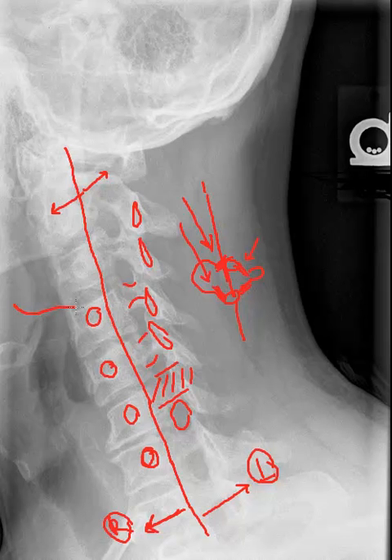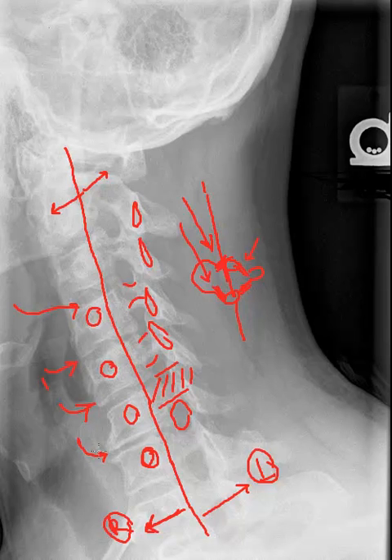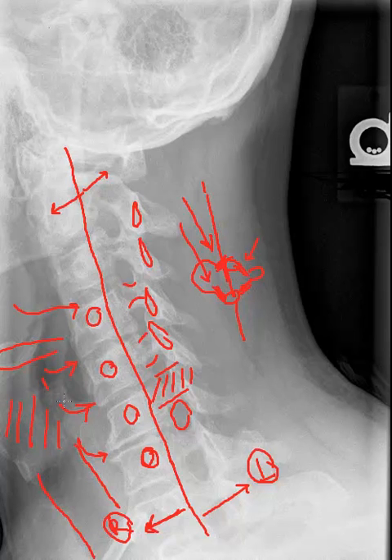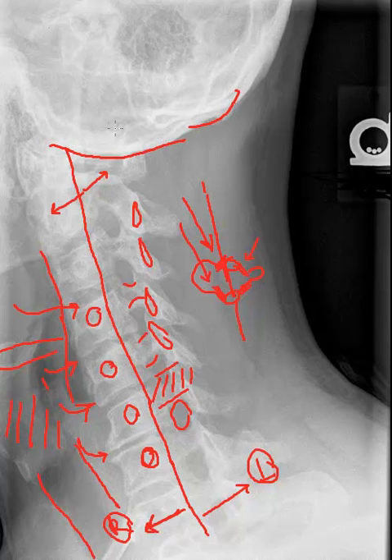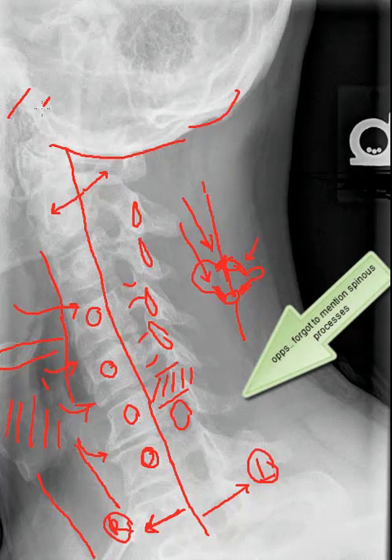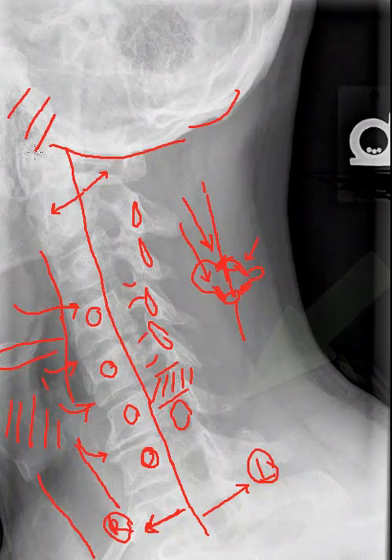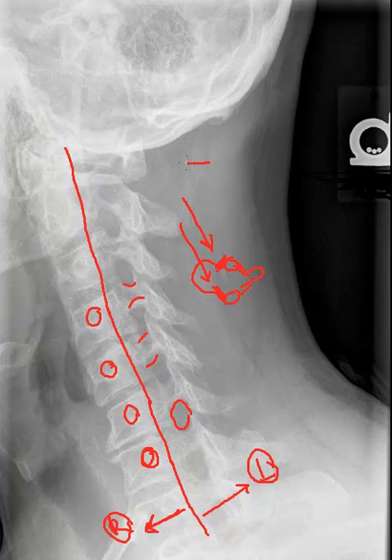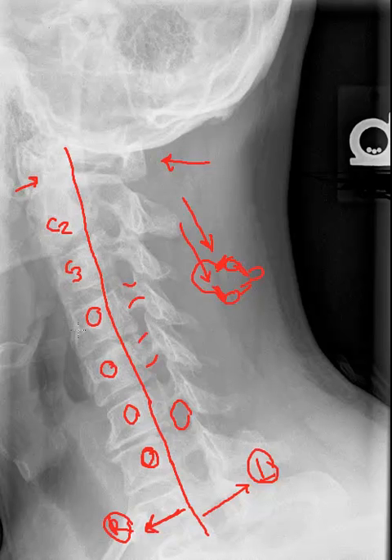To finish up with some anatomy: these are the intervertebral disc spaces. This patient demonstrates a little bit of narrowing at a particular level with some osteophyte formation, simply a sign of degeneration. Here we see the hyoid bone, some thyroid cartilage calcification, the air column in the trachea, as well as the larynx and pharynx. The skull and some portions of the mastoid air cells are also well visualized on oblique projections. Identifying specific vertebral levels can be challenging — here's the posterior arch of C1, then C2, C3, and so on. I hope this tutorial was helpful, and please join us for future tutorials.